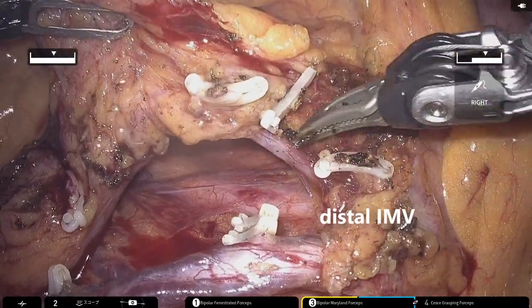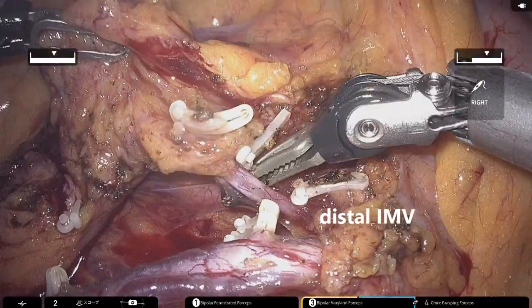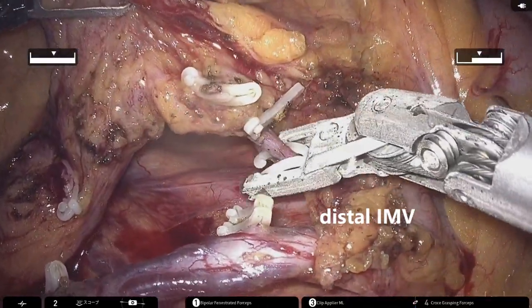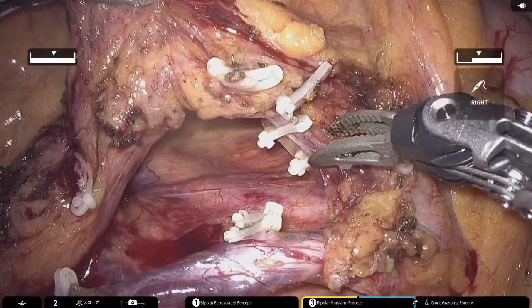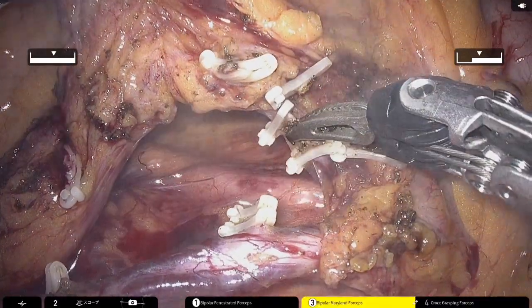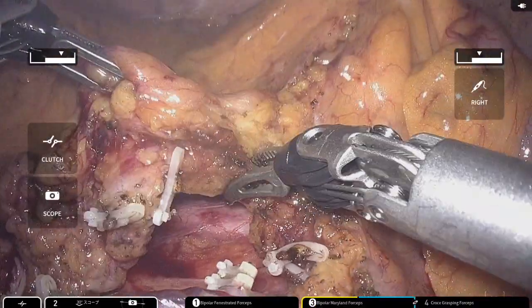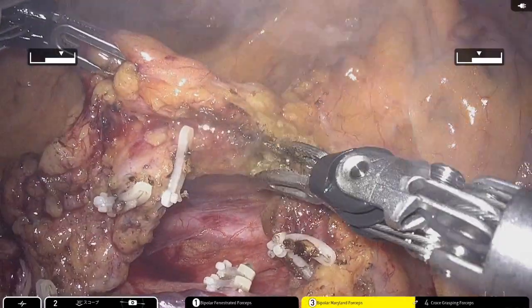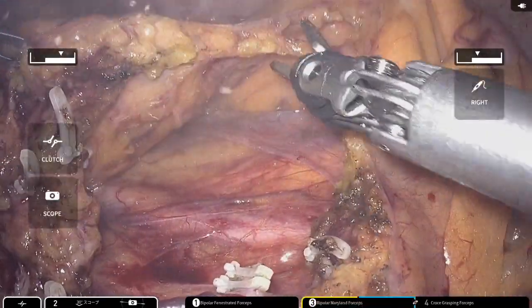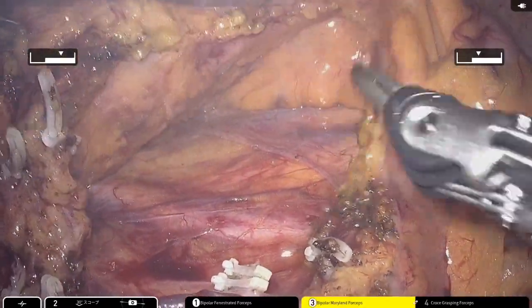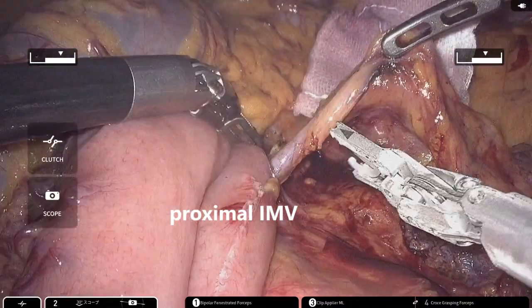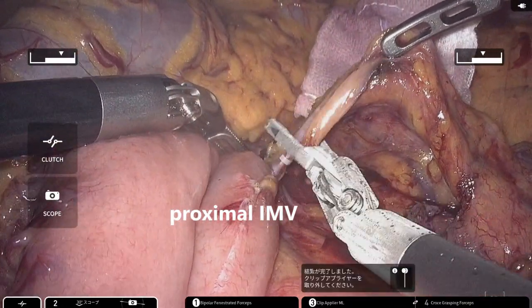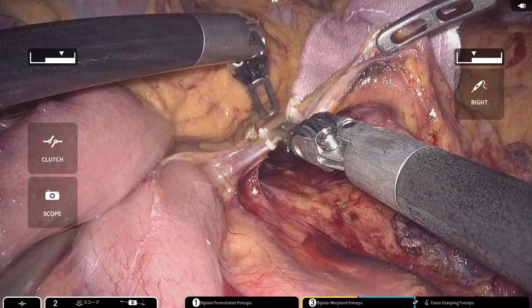After completing lateral mobilization, the bowel transection line is determined, followed by division of the distal side of the inferior mesenteric vein and the mesentery. Next, the proximal side of the inferior mesenteric vein is divided at the level of the pancreatic margin.